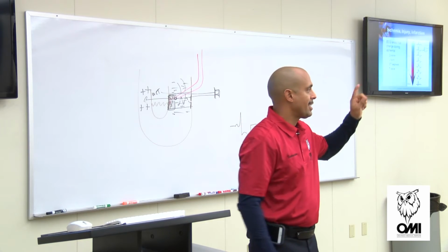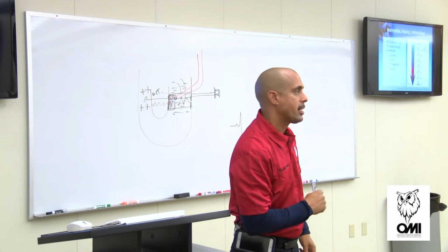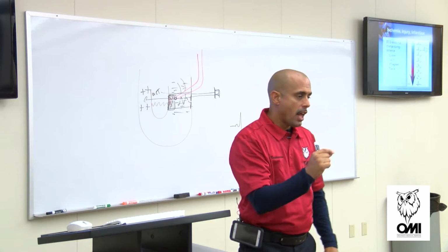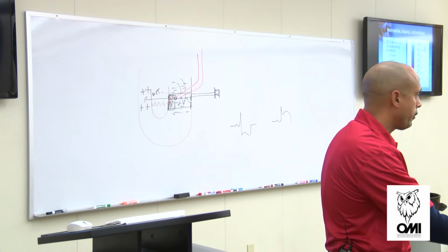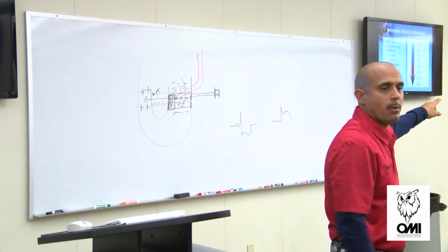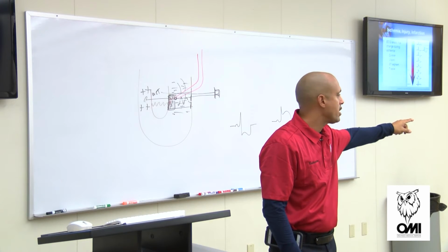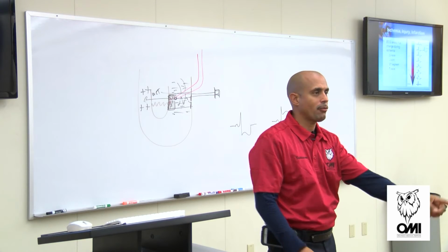Because that tissue is lacking oxygen. And what did I tell you about MIs? They are a rapid evolving process. I can see ischemia right here. And when I get to that vehicle, now it's infarcted tissue. I missed the concept. I missed the reason why we start the reperfusion early.